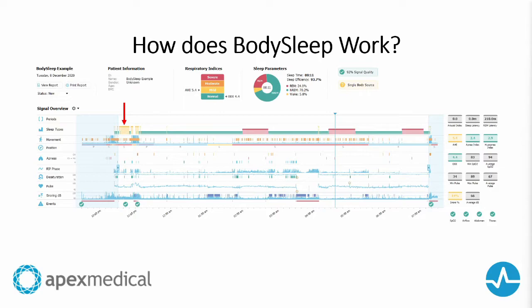This is a really useful tool if you need a good, reliable automatic analysis or just want a more accurate AHI. An overnight study can also make use of something like a sleep study log or an overnight questionnaire, but this does require that the patient fills in the answers correctly and accurately. It isn't always the case, and BodySleep aims to fix this problem by making it easier for the patient and for clinical staff.